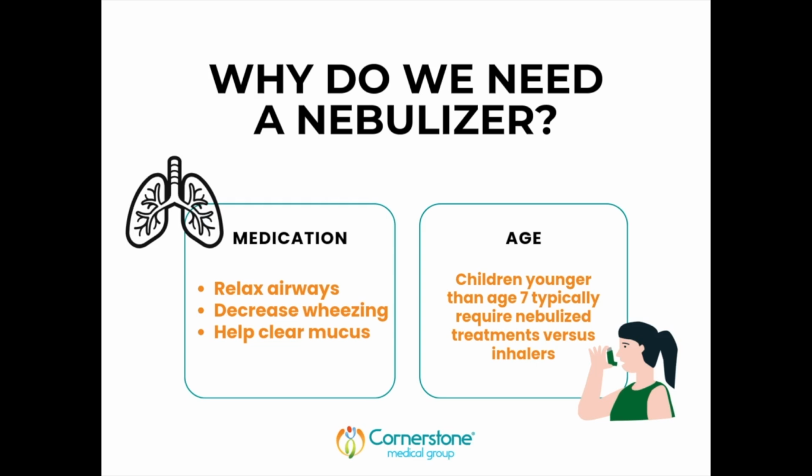Why do we need a nebulizer? A nebulizer provides medication that can relax the airways, decrease wheezing, and help clear mucus. We typically use a nebulizer in children younger than the age of 7 versus inhalers.